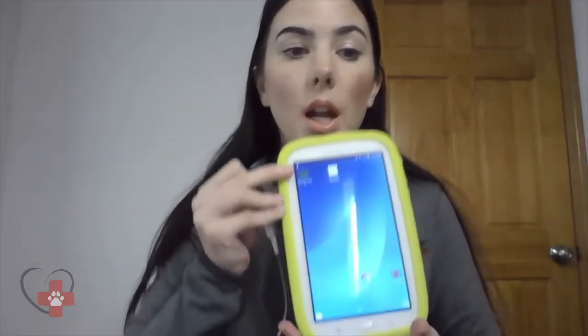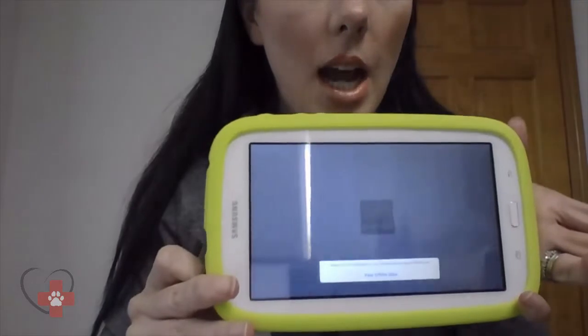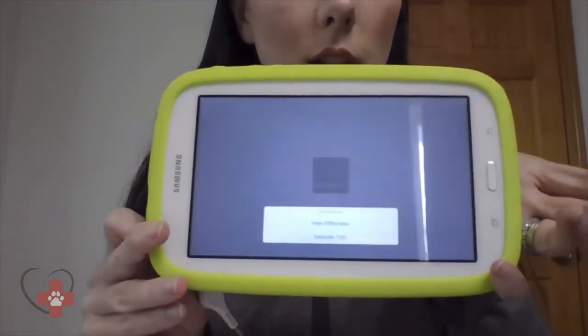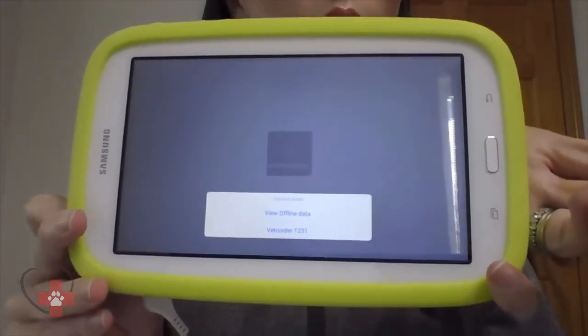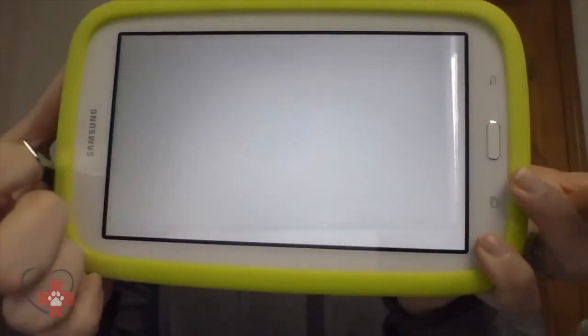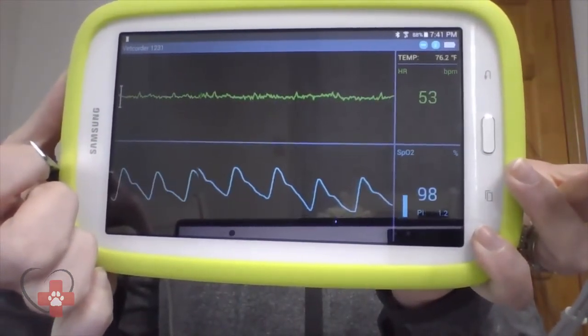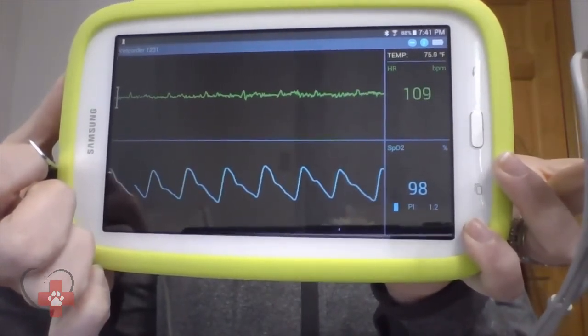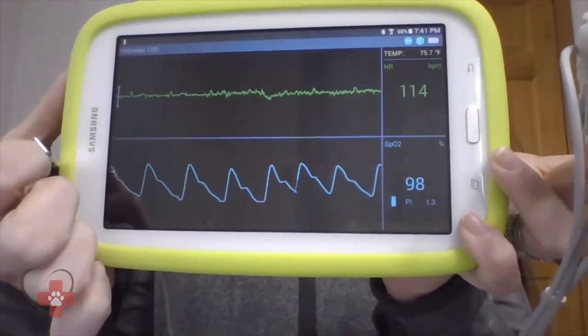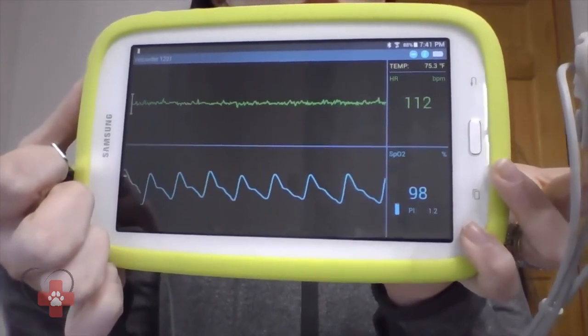Please remember to only open up the Monitor Vitals application. Once we open that, we are going to get the option to either view offline data or select our Vet Quarter — those are the last four serial numbers of our Vet Quarter. Once we select our Vet Quarter, it'll bring you right into our Monitor Vitals screen. You can keep this tablet or phone in your pocket, walk away 30 to 50 feet, and still monitor your patient. A lot of clinics like to use this as a bigger device during procedures to get a better view of the vitals.